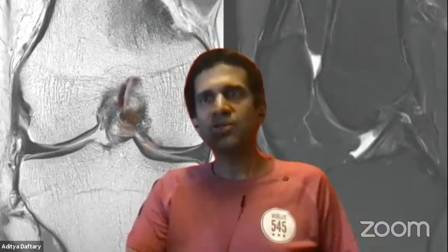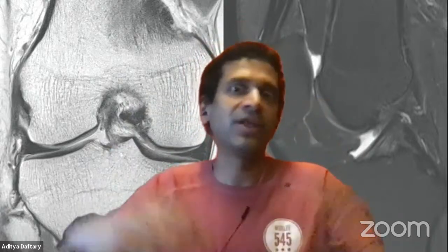But I think reading an MRI is more important, because sometimes a lot of edema confuses you and they end up reporting, as Sajeer rightly showed, that everything is torn. So when you're looking at an acute MRI, you're reading everything with a pinch of salt. And when you're reading an MRI delayed, you're reading with a fine-tooth comb, because now you're looking for all the little things, whereas when everything looks exaggerated.